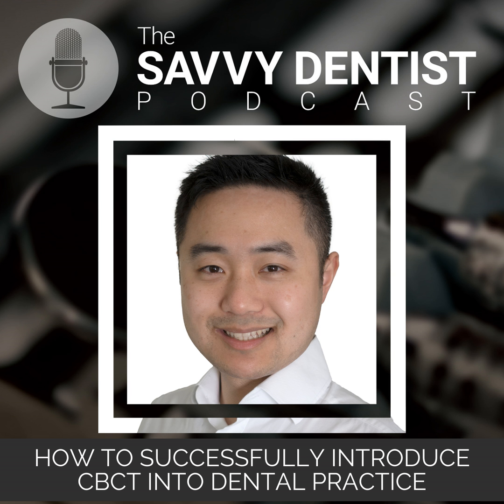It was really infiltrating through the facial bones, and it was even extending out into the soft tissue, which is just something that you don't really appreciate on 2D imaging. In my head, alarm bells started ringing for lymphoma, because lymphoma is a transspatial malignancy that doesn't necessarily destroy bone, but just goes through things, right? And guess what? We sent this guy immediately for ENT review, and the biopsy came back. It was sinonasal non-Hodgkin's lymphoma. Oh gosh. Yeah, I know. I've remembered that case quite well.